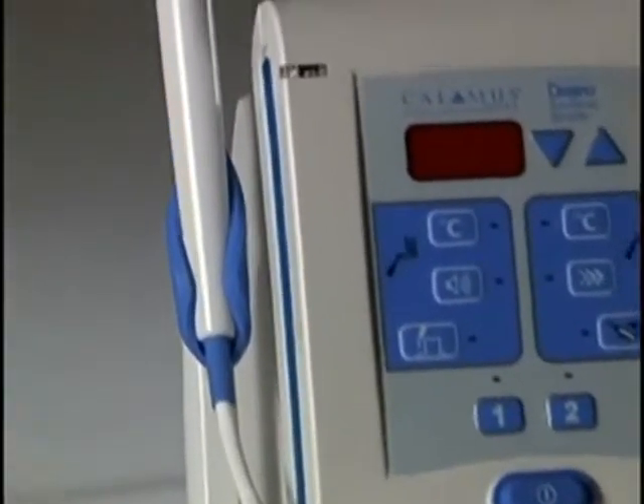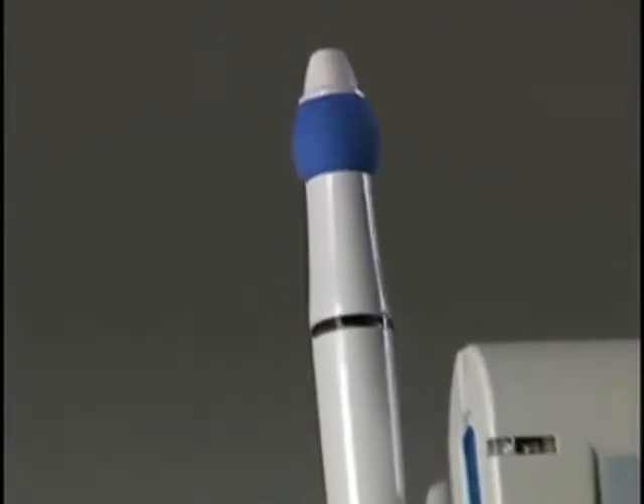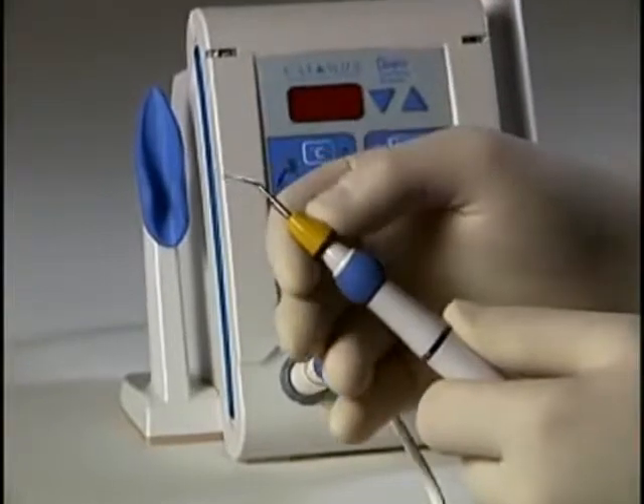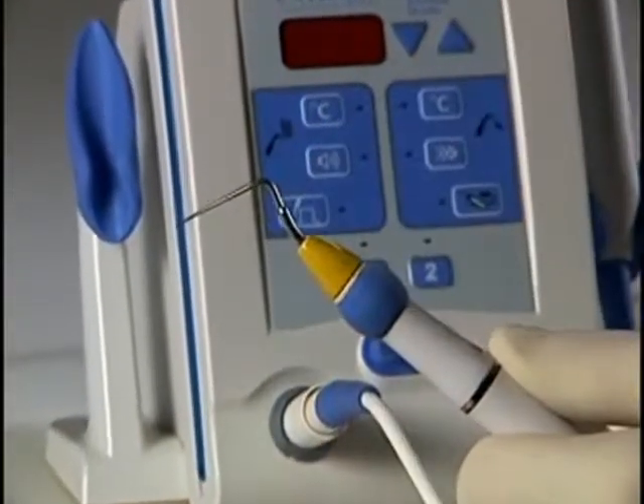Operation of the Calamus Pack handpiece is simple and intuitive. With the unit off, the electric heat plugger or EHP tip is inserted into the pack handpiece and slowly rotated until it locks into place.